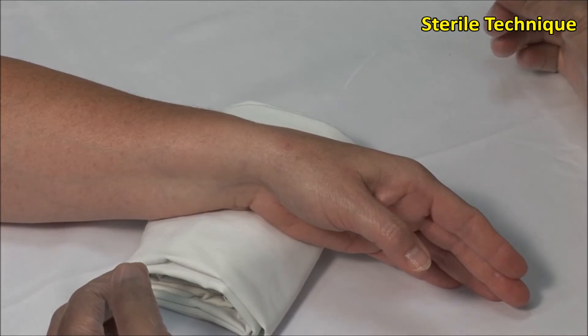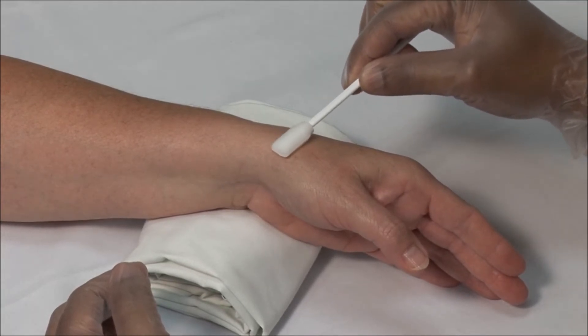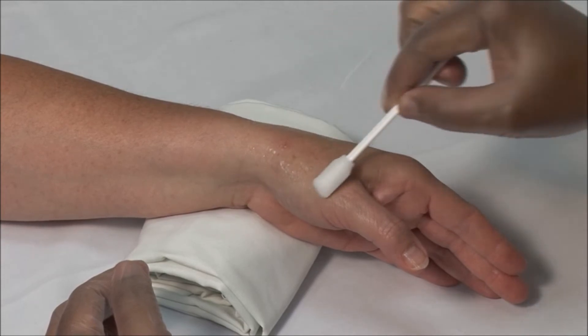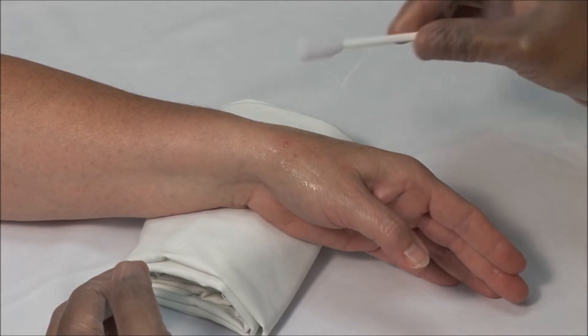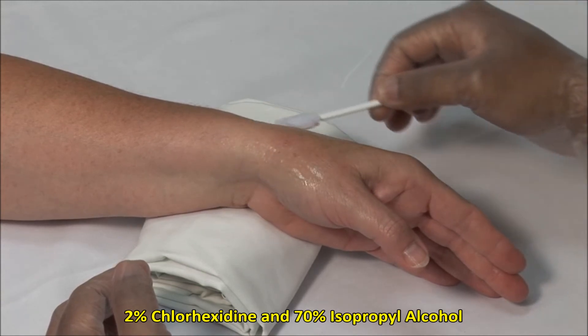meaning that once the area is cleaned, it must not be touched with anything but sterile needles. Scrub the site of injection and then clean in an outward fashion. Here I am using 2% chlorhexidine with 70% isopropyl alcohol.